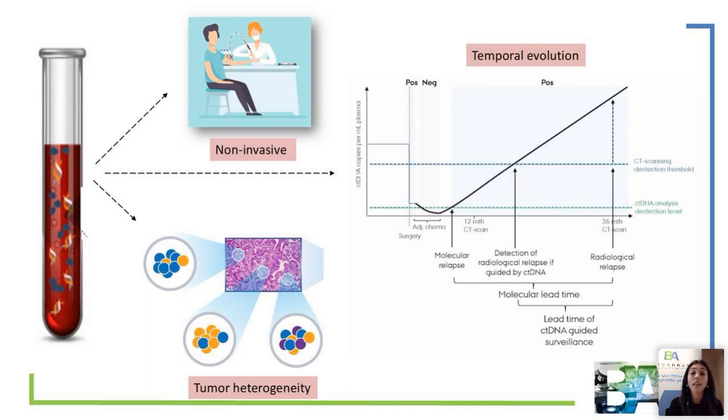And this is because they have clear advantages versus the strong gold standard to these days, which is the solid tumor piece of tissue that we use for genetic screening. Not only because of those advantages, but also because the results we are obtaining from liquid biopsies are really promising. First of all, we have a really high rate of concordance with the mutations that we are finding in the tissue. So this increases the confidence we have in liquid biopsies and helps us keep pushing forward to use them as a real tool with clinical implications in the daily life of oncologists and patients with cancer.